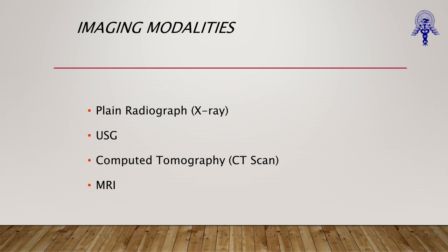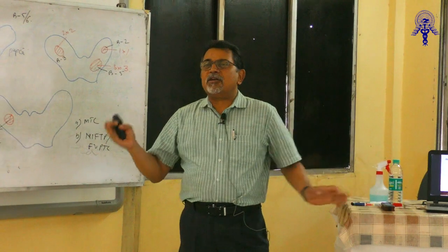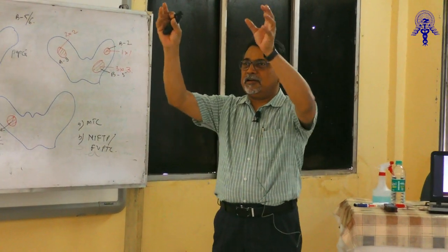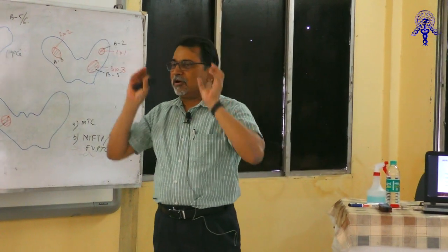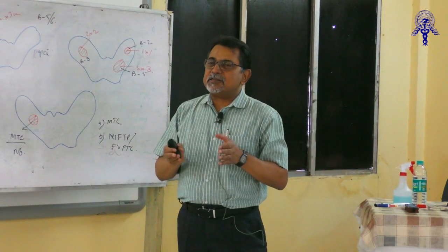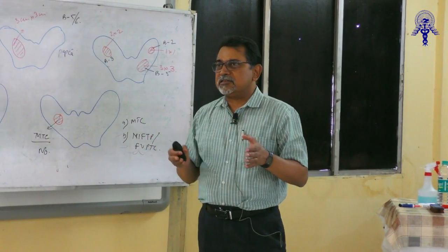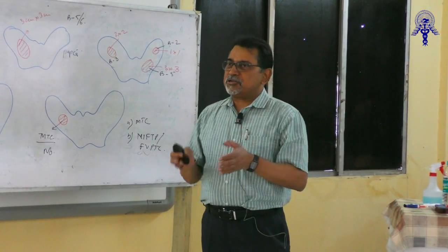It is not very clear. So we cannot understand the details of the paranasal sinuses distribution, and paranasal sinuses are not like two maxillary and a little bit of ethmoid and two frontal and sphenoid. So they are so much complicated. That is why CT scan is mandatory for diagnosing all the paranasal sinuses diseases, be it inflammatory, be it tumor.